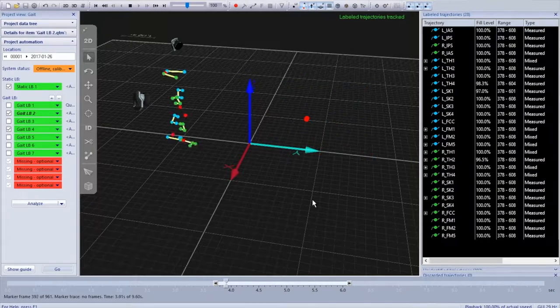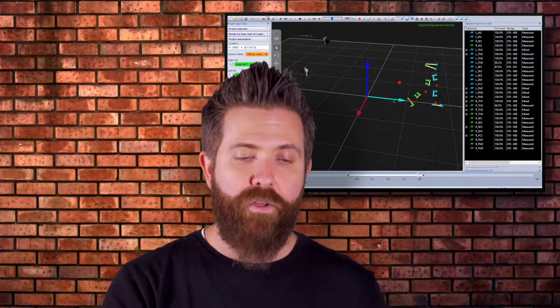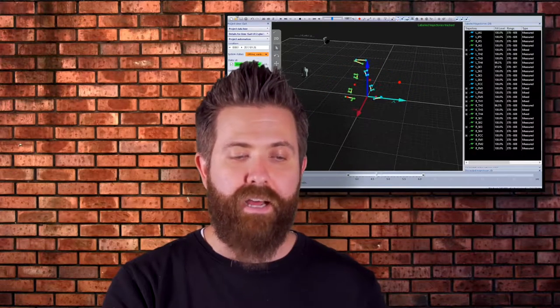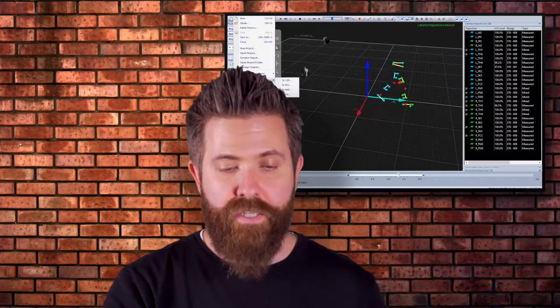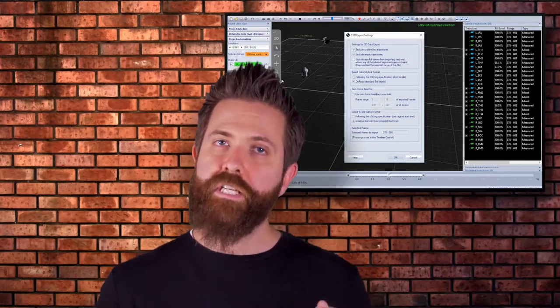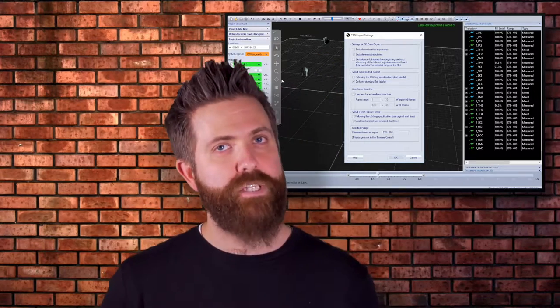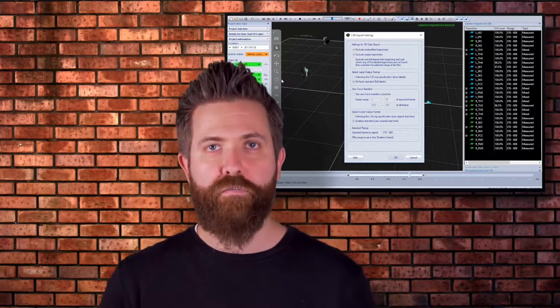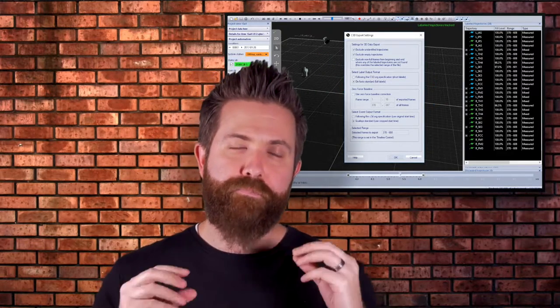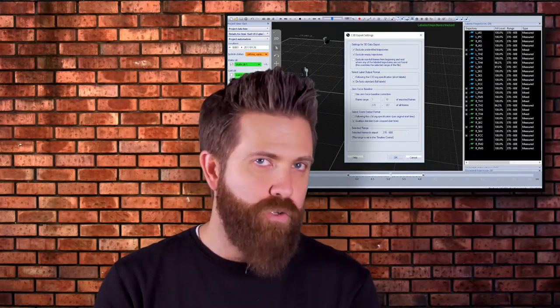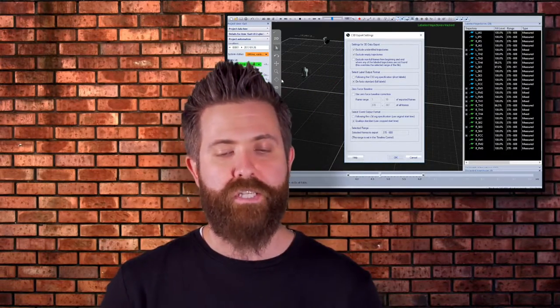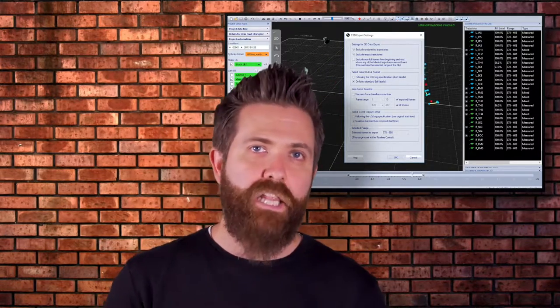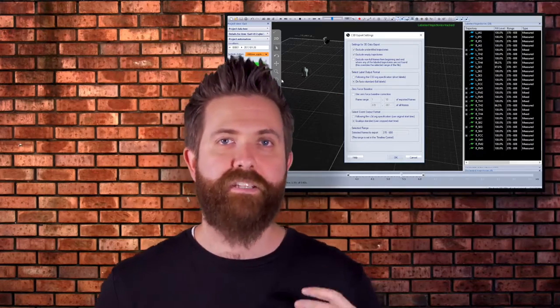How do we get our data out? In this case, we're going to export to C3D. C3D is the industry standard for biomechanical data coming out of the motion capture system, and it's not limited just to kinematics.